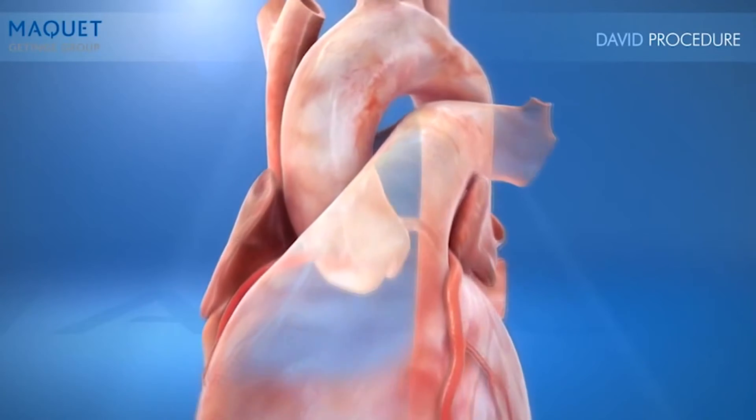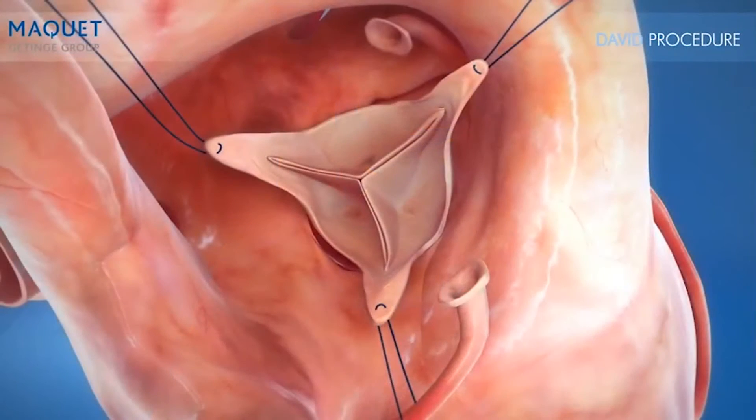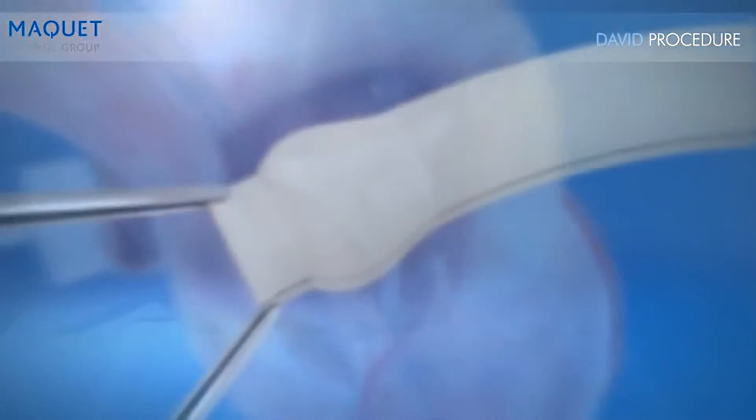During the David I procedure, the diseased aortic and sinus tissue is removed, while maintaining the aortic valve, and the native coronary buttons are detached. The CardioRoute proximal collar length is measured against the valve remnants and the graft collar is trimmed, so the top of the commissures will reach the level of the new sinotubular junction.